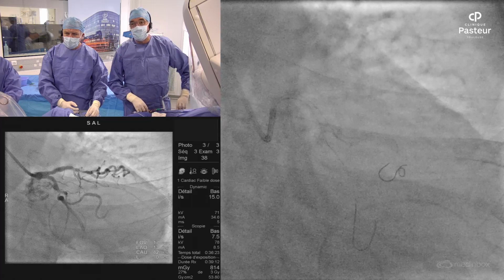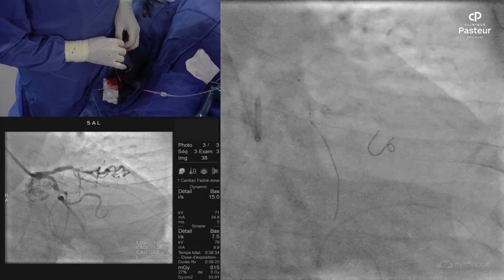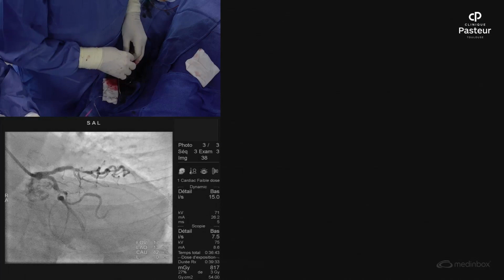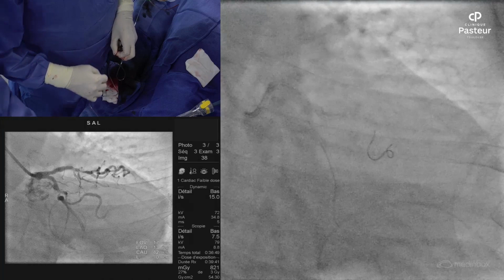So we could anticipate that at present time it's too early to take the stent. Go on here. But maybe we can do provisional. Yeah. Stent delivery into that vessel will be very, very difficult, I think, because the additional friction of the stent balloon on the wire bias will take the stent against the already deployed stent. So I would try very hard now not to make this a two-stent procedure.